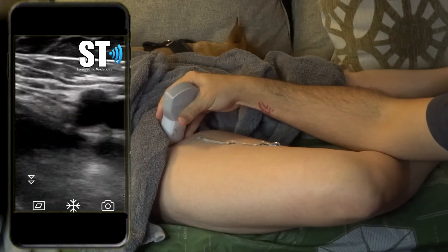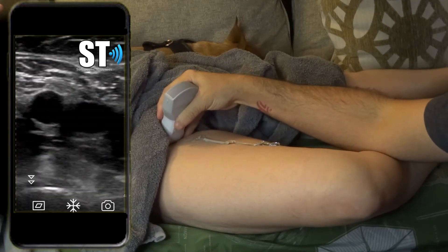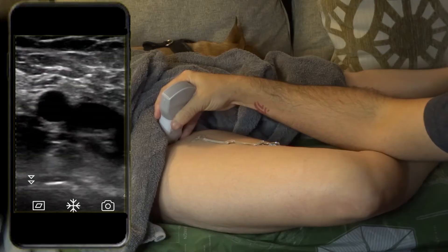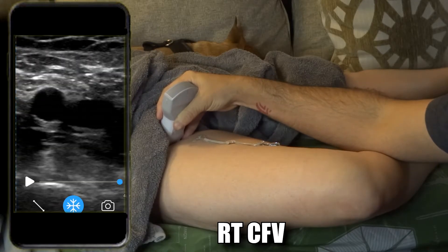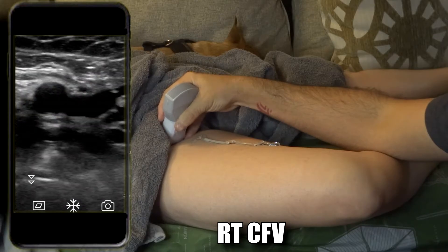Let's do a venous protocol with the V-scan. We'll begin in the right inguinal canal, right below the inguinal ring. There you can see the common femoral artery and common femoral vein. Freeze, take the picture, unfreeze.